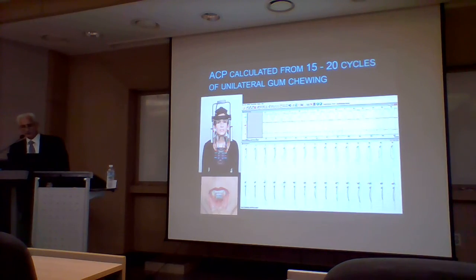So to do this study, we used the jaw tracker, the BioResearch jaw tracker, and the BioResearch EMG, and we had the patients chew gum, which is a non-destroyable food source. You can keep chewing gum. You know, it won't get ruined. So you can have someone chew repeatedly for a long period of time. 껌을 이제 씹으면서 저희는 좀 설치하고 EMG 같이 걸어놓고.